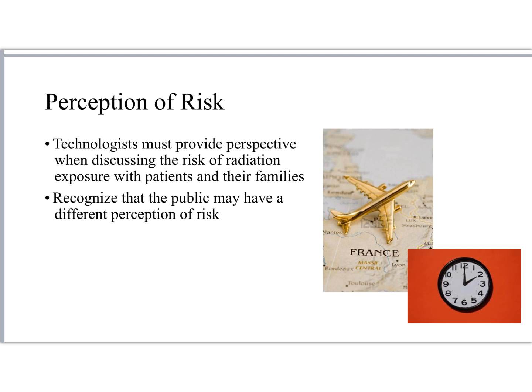So for example, the amount of natural background radiation that would equal an X-ray of the chest is about 2 weeks, right? But for a CT of the chest, it's about 2 years, right? So I think that time thing gives me a way to quantify it that makes more sense to most patients than talking about millisieverts and gray and things like that.